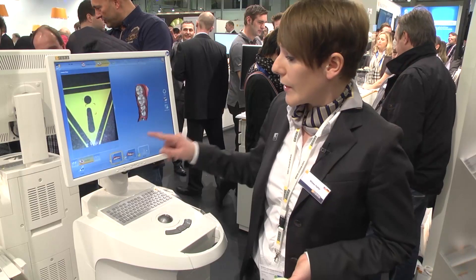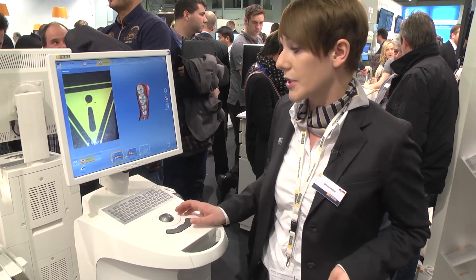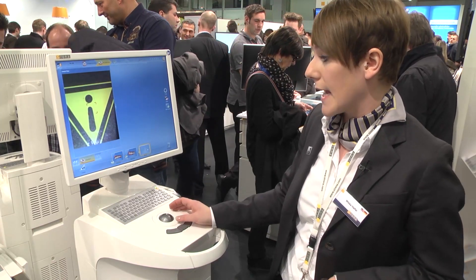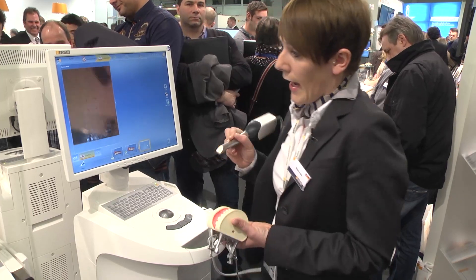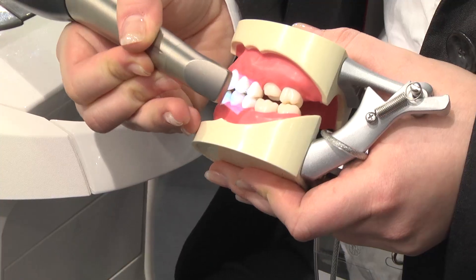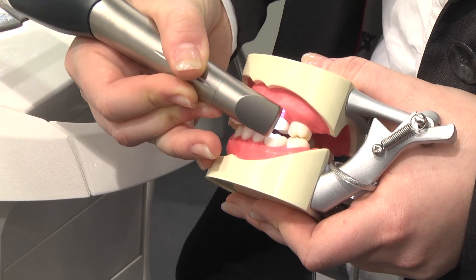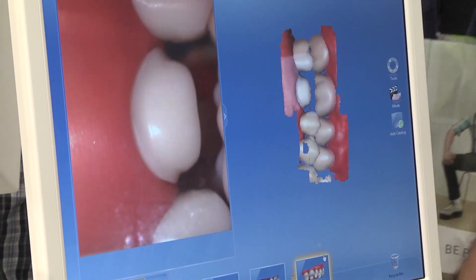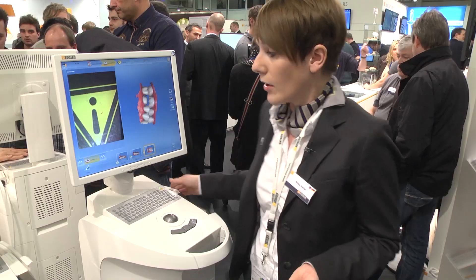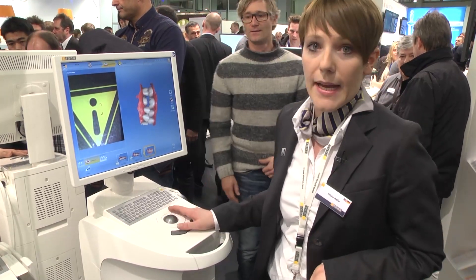We also need information from the buccal scan to understand how both arches fit together. We open the buccal window and make a video of the buccal area — it only takes about five seconds, making it quite easy to perform and comfortable for the patient.